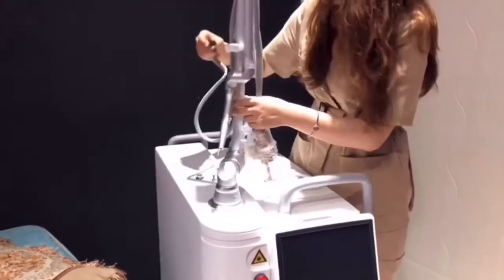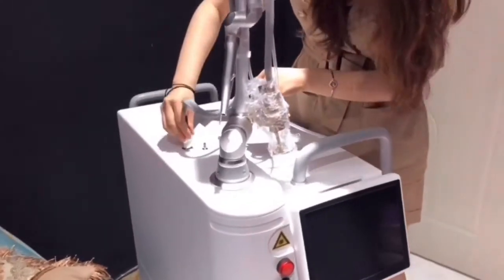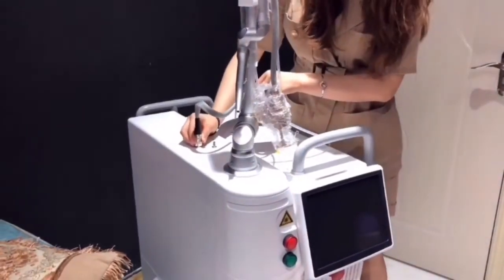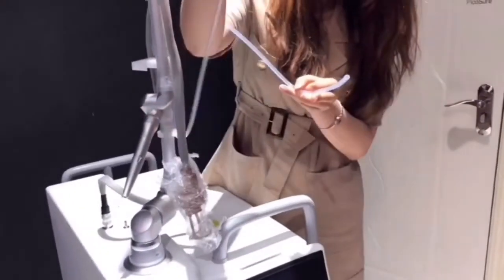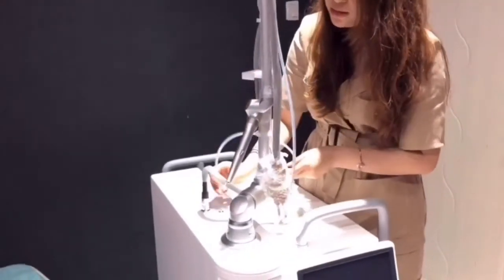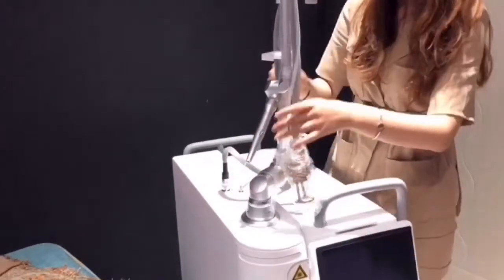Connect the fractional pipe to the machine and make it tight. There are two plastic pipes — connect the longer pipe to the machine and connect the shorter pipe to the probe.